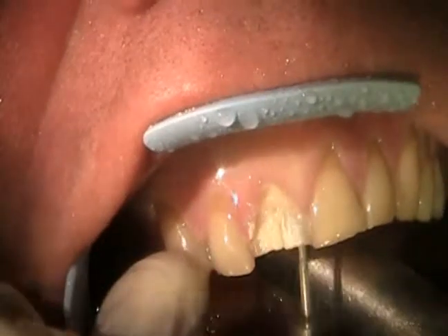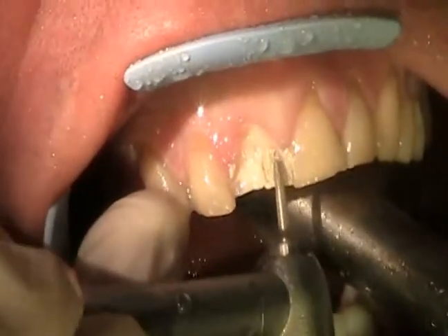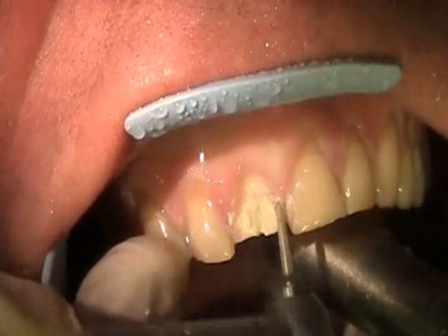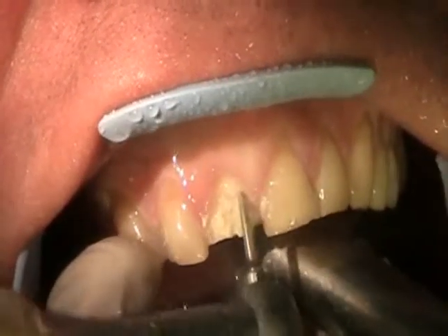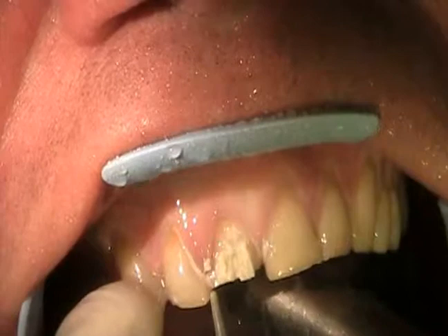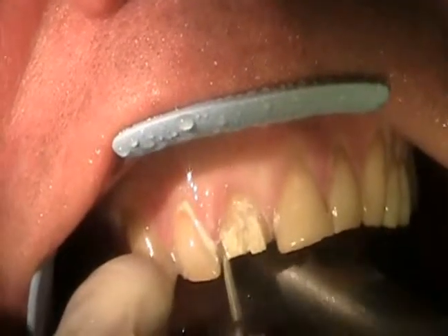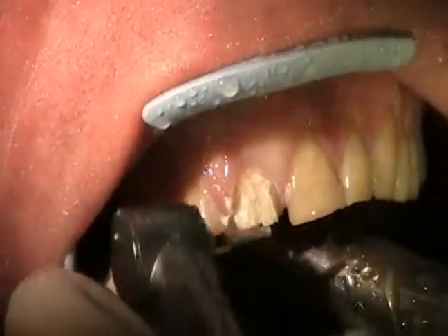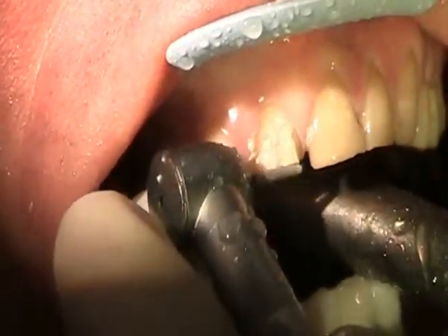So now we go and strip away the rest of the enamel. Everyone thinks at this point that we're grinding these teeth down to little pegs, and that's really not the case, although they certainly do look small. But we're only taking away a millimeter and a half of tooth enamel, so that still leaves quite a bit of tooth left.